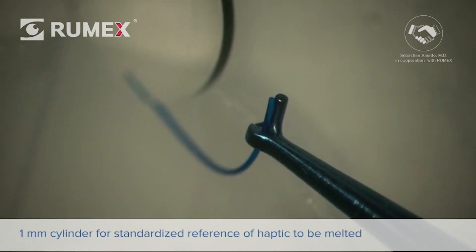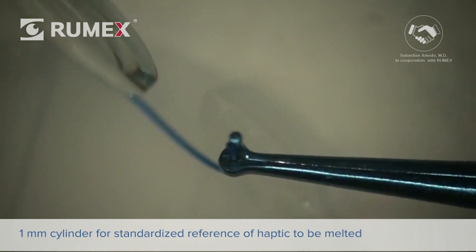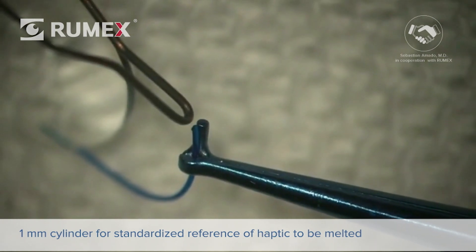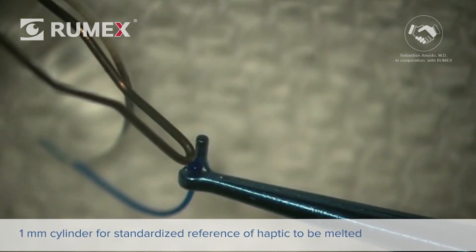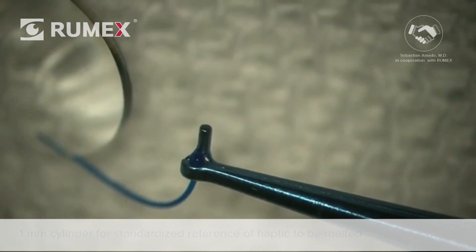Another important feature is a 1 mm reference cylinder attached to one of the grasping arms. Its function is to give a standardized, quick reference of the amount of haptic to be melted. With the help of the Perfect Flanger, along with a low-temp cautery, it is easy to create a flange of the correct shape and size every time.